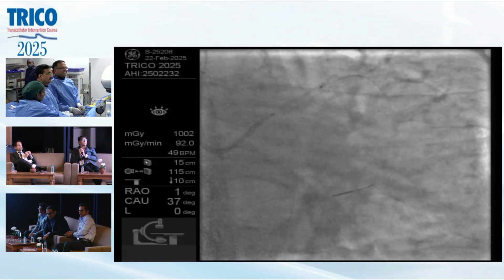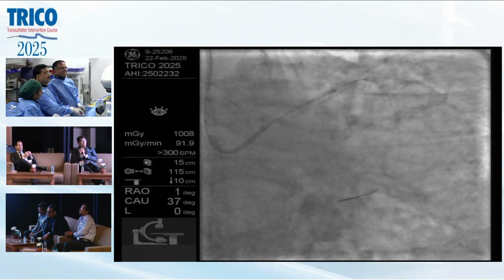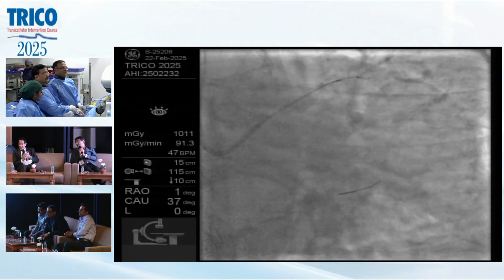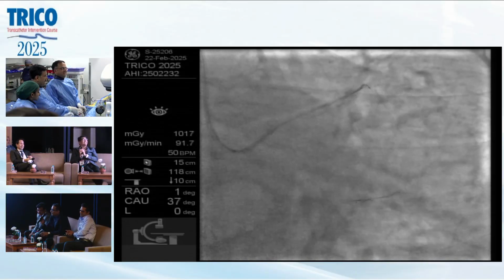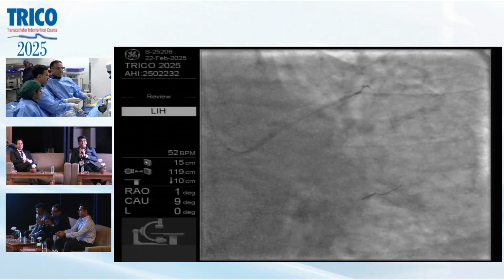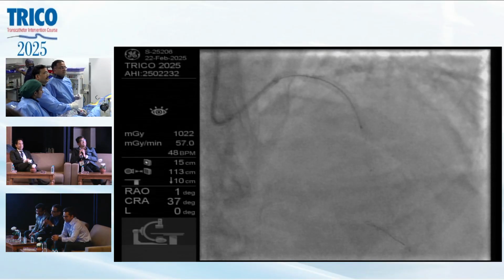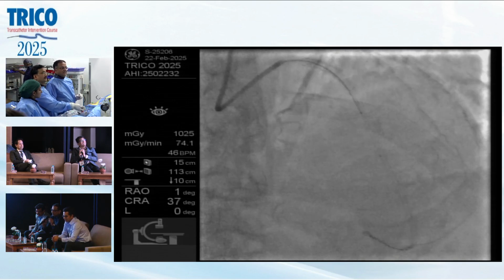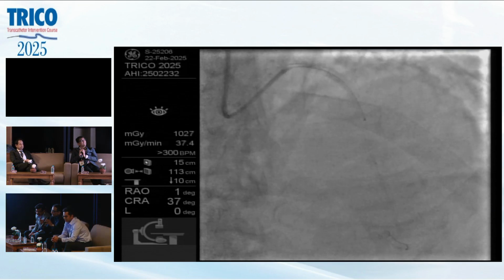I guess philosophically, we're calling this stent failure, but I would say 17 years of a bare metal stent is a stent success. Perhaps we should rephrase, rather than stent failure, as a caged vessel. So you'd like to get the best area that you possibly could, and instead of having a separation of tissue between the two layers of stent, have as little in between them as possible, so you get the best stented area.